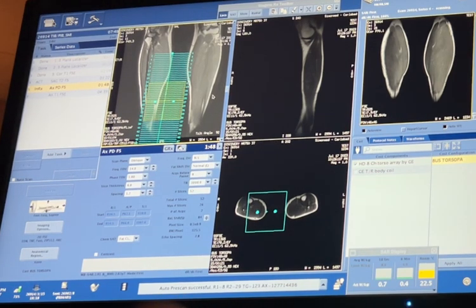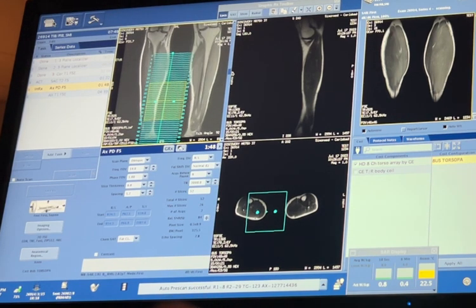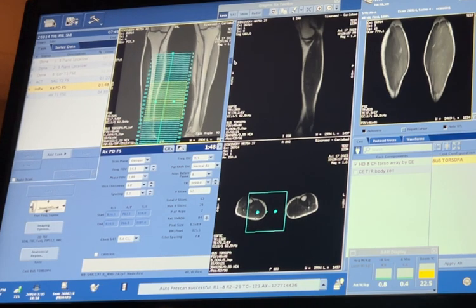So why don't you find the tibia? Okay. I thought I closed that. The tibia? How did we not notice that whole thing? I know. Yeah, one more. One more. There we go.